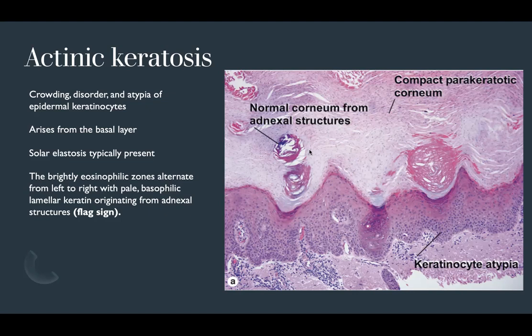The sharp cutoff between the interfollicular regions — where you see loss of granular layer and parakeratosis — and the adnexal structures, where orthokeratosis is preserved, is referred to as the flag sign. With abundant sun exposure, you'll also see solar elastosis present.